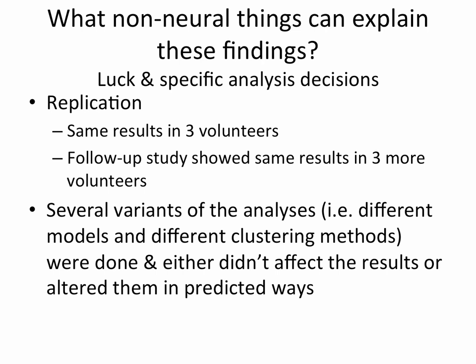Yes? Did you vary the time window, like for each neuronal pattern? Like did the 20 patterns arise if you only used a specific time window? Like what if you shortened it? So in this case, the main result was done not assuming any model shape. Every trial of the task was a minute long.